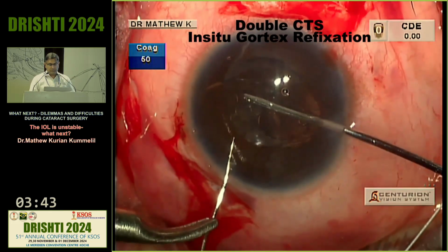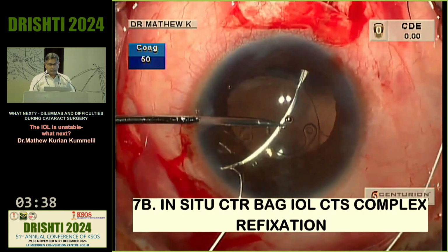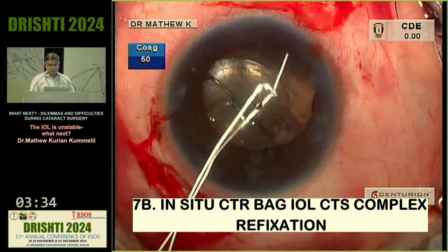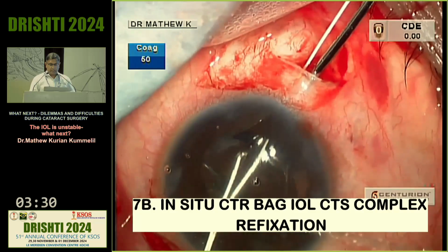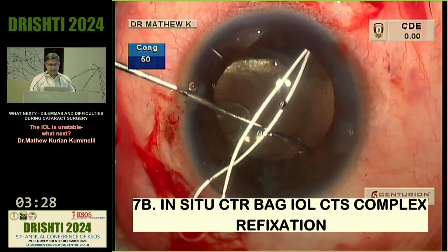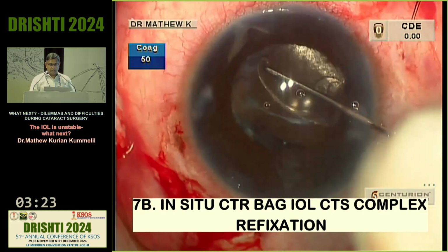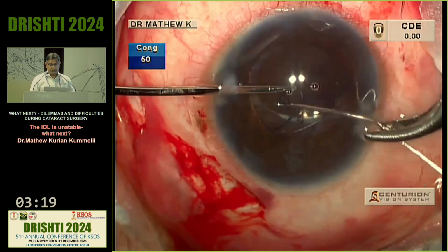So this time it is Gore-Tex. I thread it through the eyelet of the CTS in situ, and this is the entire CTR bag IOL CTS complex refixation, and that also finally ended up giving a stable, decent vision to this patient.